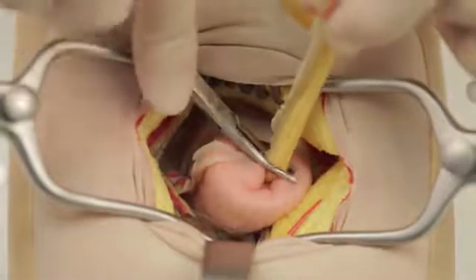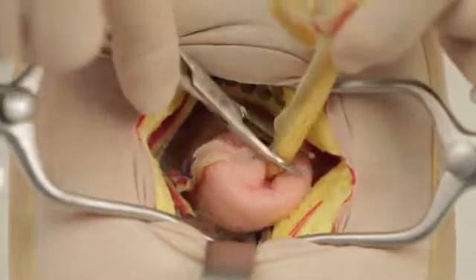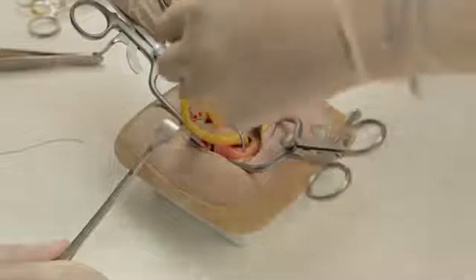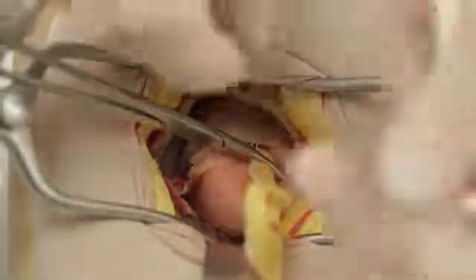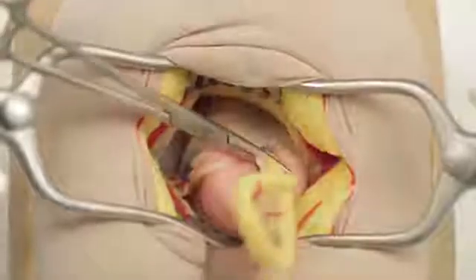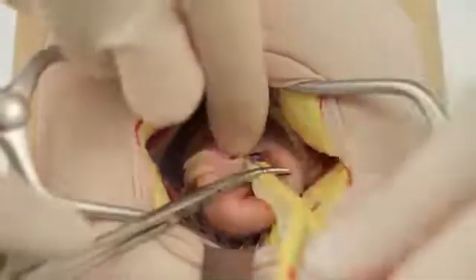Crush the appendix base with a haemostat and replace it distal to the crushed segment. Doubly ligate the crushed segment with 2-O Vicryl. Divide the appendix just proximal to the haemostat. Place these instruments in a dish for contaminated articles.